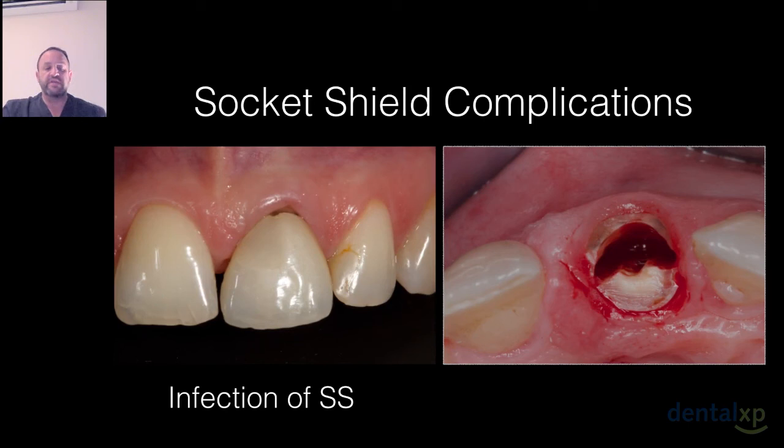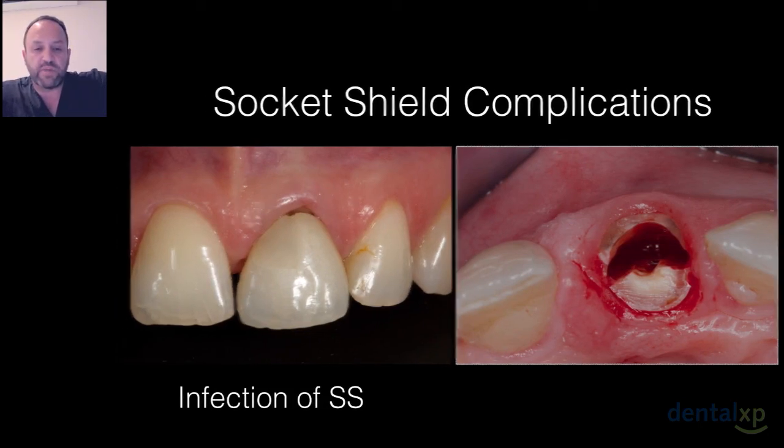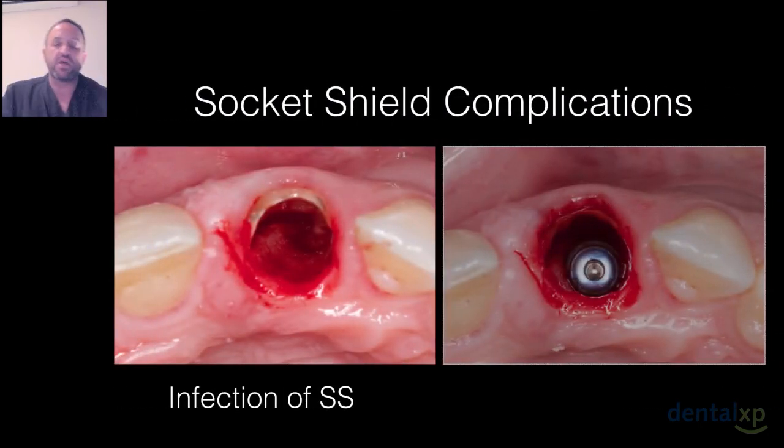And here you can see the classic type of scenario that we did at a later stage. Now here you can see the removal of the palatal side, and you can see here was one of the cases where we actually thinned the part out too much, and it was about 1 millimeter thick, and as a result of that there was a lot more flexion in the root. And even though it was firm, so when I took my tweezer and I shook it, it was still firm.